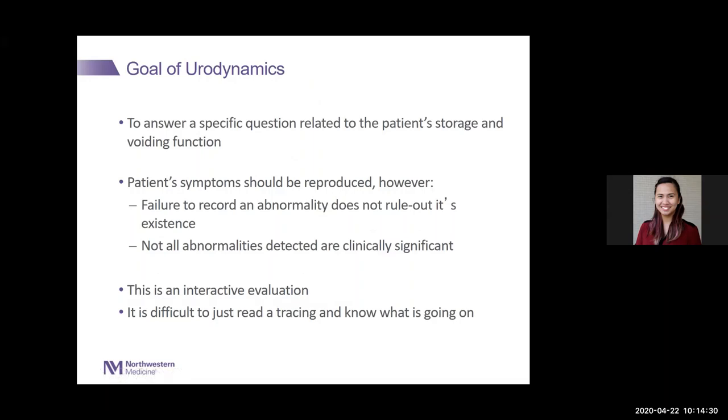The other thing you have to remember when you do urodynamics is that you need to have a specific question that you're trying to answer. And so just doing urodynamics because someone's there and has a specific diagnosis isn't the right thing to do necessarily. And you want to make sure in the urodynamics that their symptoms are actually reproduced.